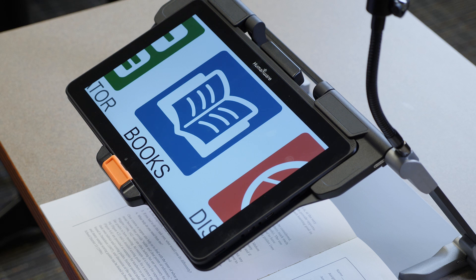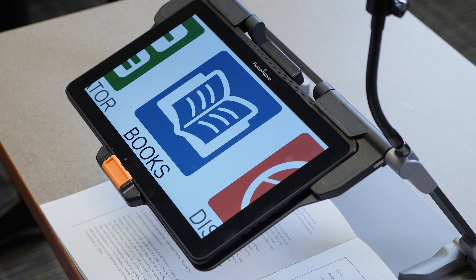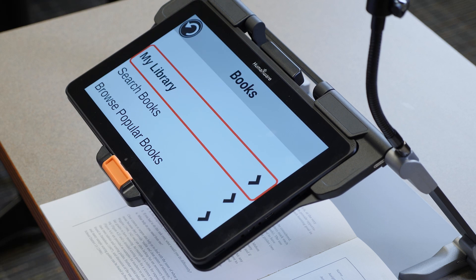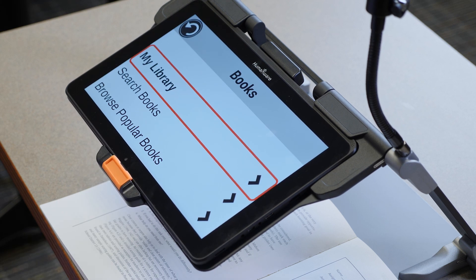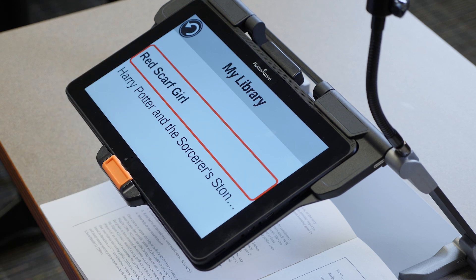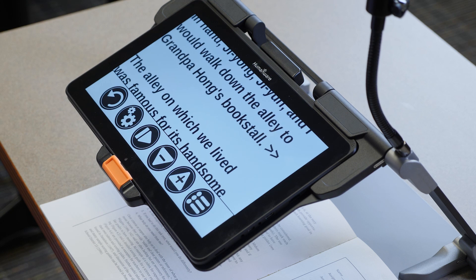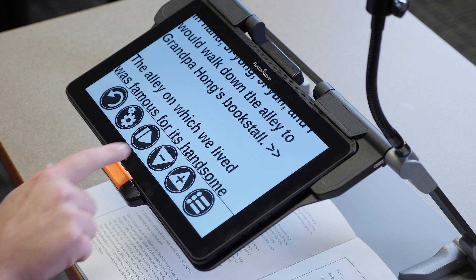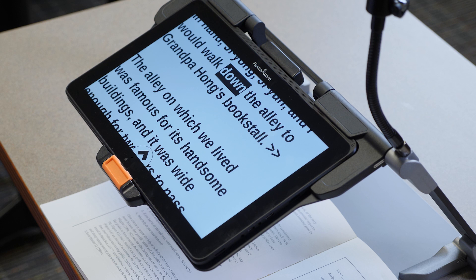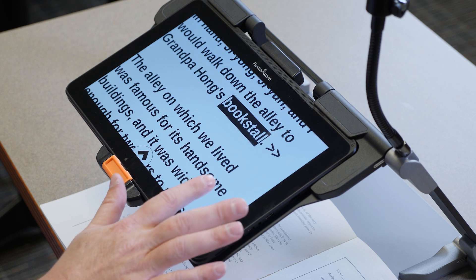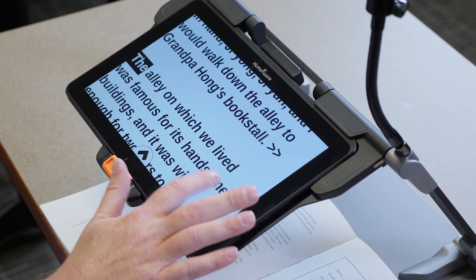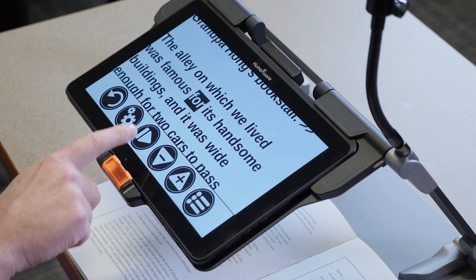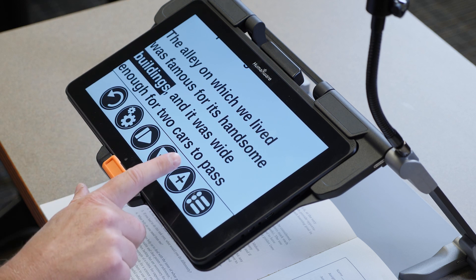The next selection is the Books application. The Books application gives you access to all the books within the Bookshare app. So Bookshare.org, we can search for everything that's in our library. We can search for popular books. So I can go into my library. I can select the Red Scarf Girl. And what I can do is I can have Red Scarf Girl read to me. I walked down the alley to Grandpa Hans Bookstall. The alley on which we lived was famous for its handsome building. I can also pause that.